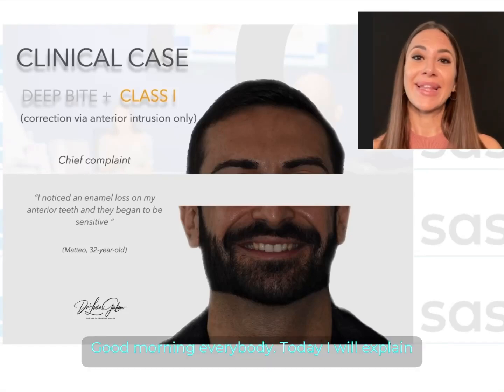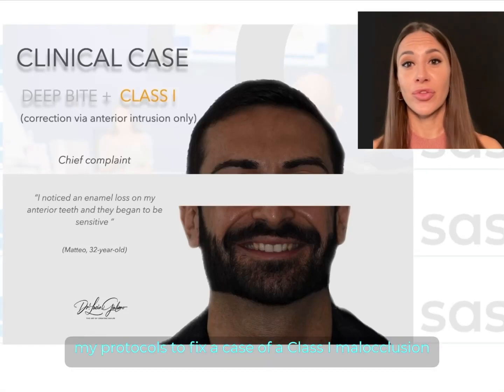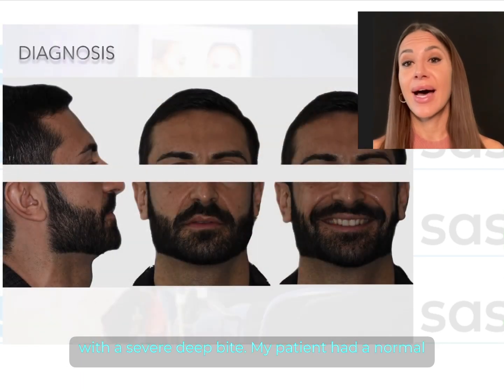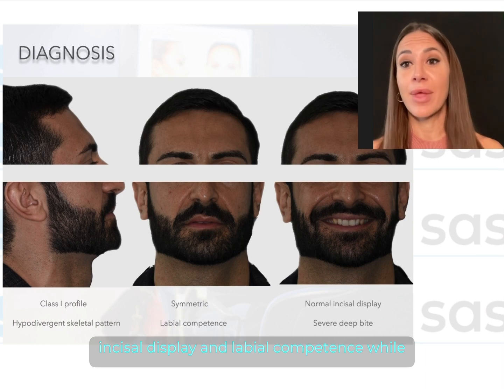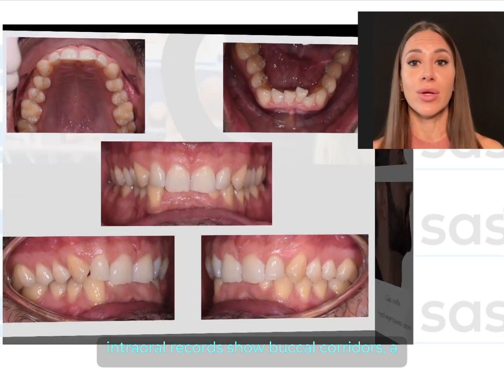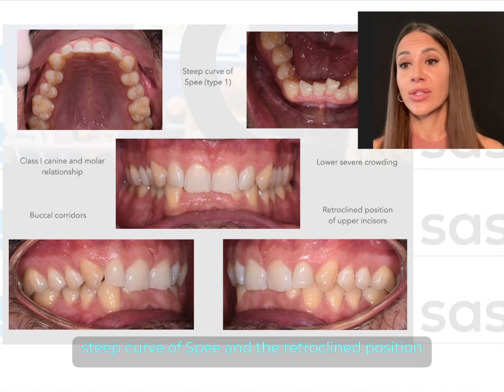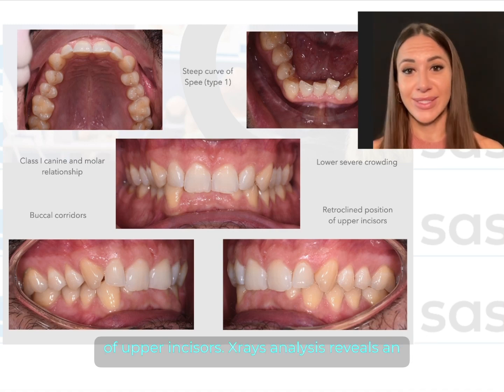Good morning, everybody. Today I will explain my protocols to fix a case of a class 1 malocclusion with a severe deep bite. My patient had a normal incisal display and labial competence, while intraoral records show buccal corridors, a steep curve of Spee, and a retroclined position of upper incisors.